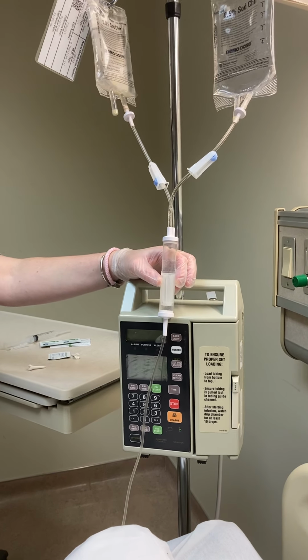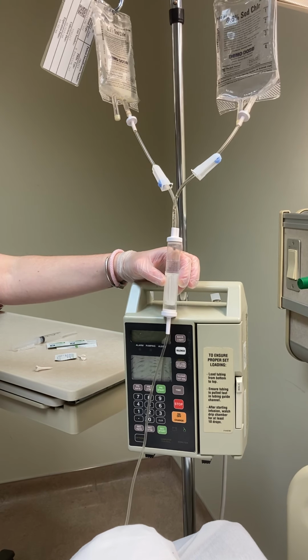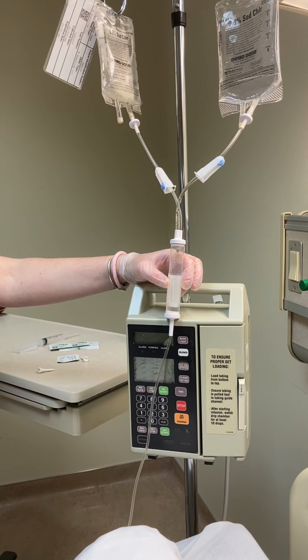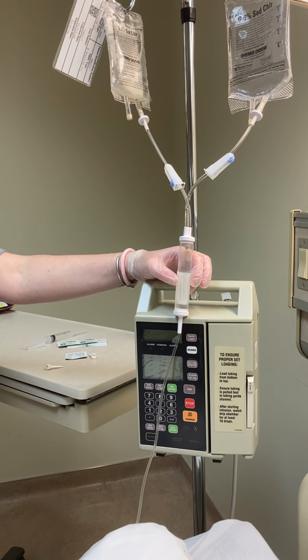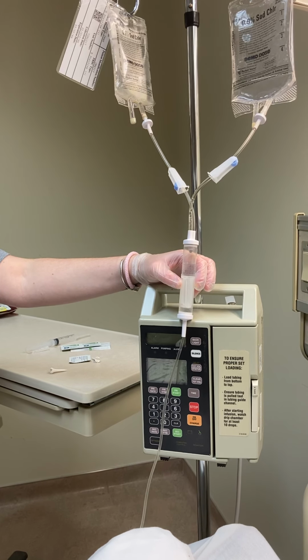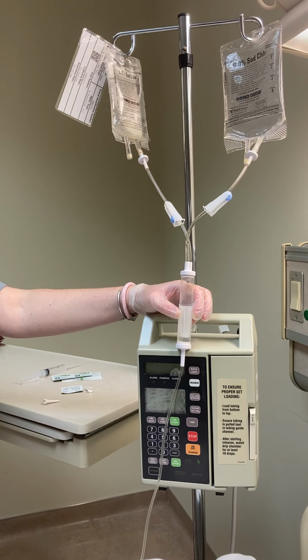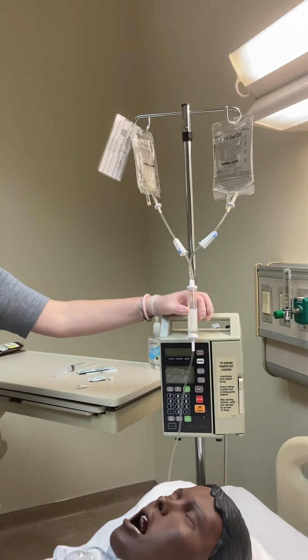So start slow and then move up from there. With 20 drops per minute, about every 3 seconds, I should have a drop. And I watch with my watch, and I'm getting 1 drop every 3 seconds for 20 drops per minute.